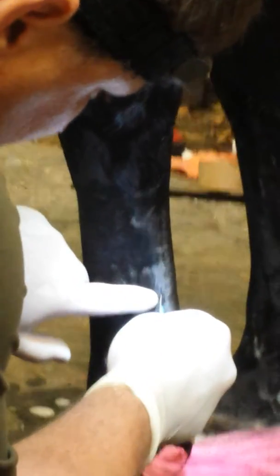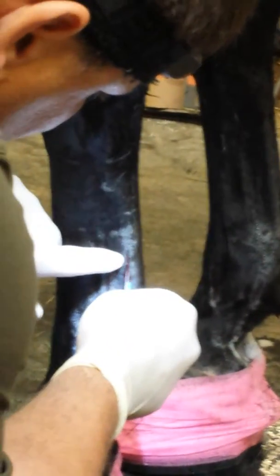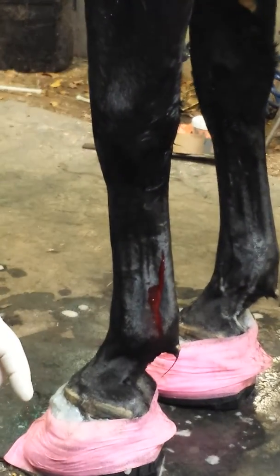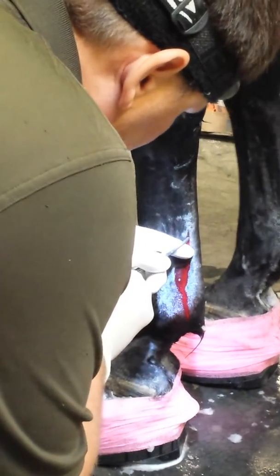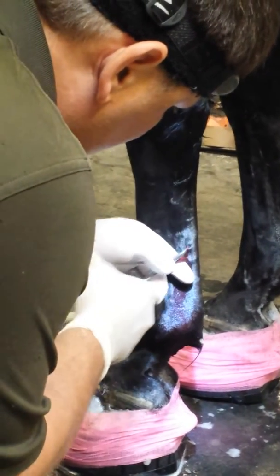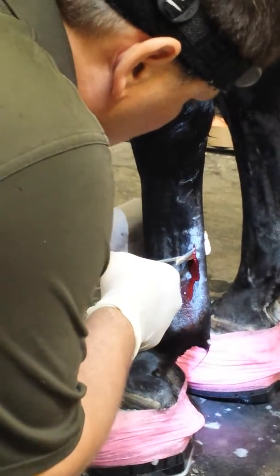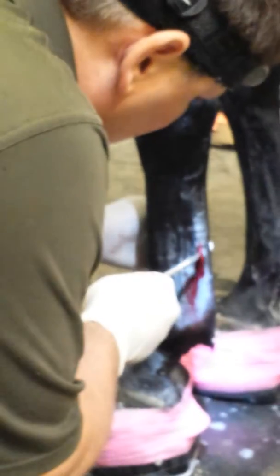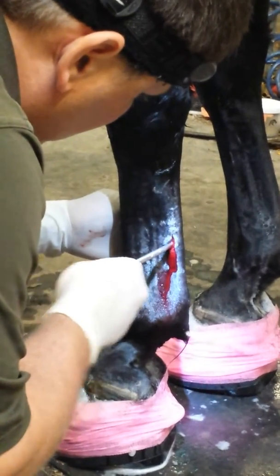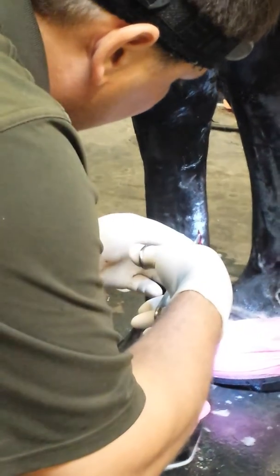Over the juncture of the deep and superficial, just through the skin, about mid-cannon. You use your instrument to go between the deep and superficial. You can palpate the other side. I'm putting it in, I'm making that tunnel — all the way around to the inside where I can feel that. I'm staying right, keeping really close to the deep. If we're inside that paratenon, then we know we're not going to have the nerves.